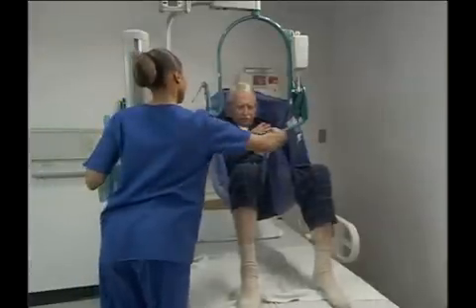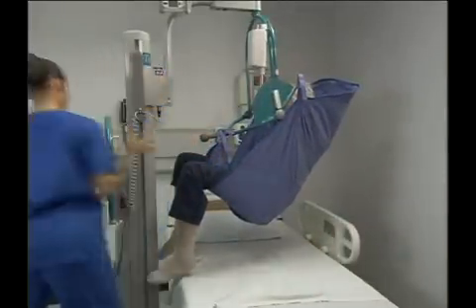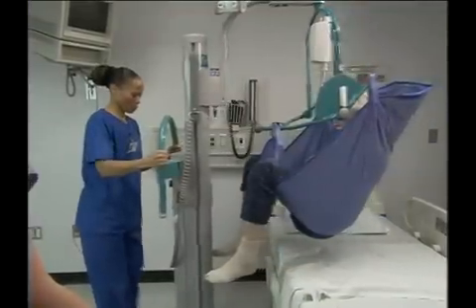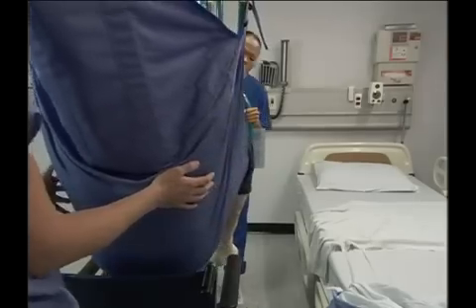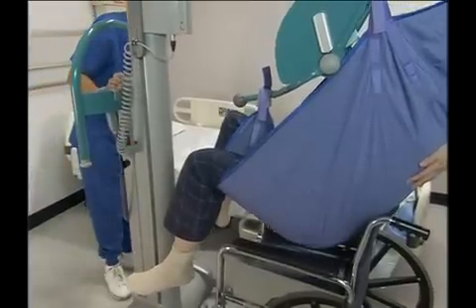Turn the person so he is facing the mast of the lift and his body is centered over the base. Next, unlock the wheels of the lift and move the lift so the person is over the seat of the wheelchair. Spread the legs of the lift apart as necessary in order to straddle the wheelchair. The person's back should face toward the wheelchair. Next, gently lower the person into the wheelchair.